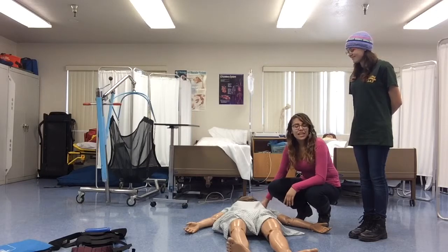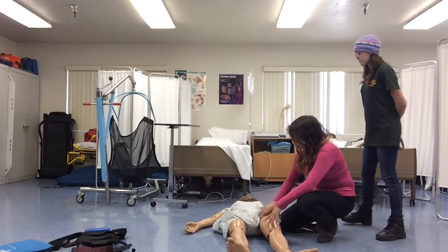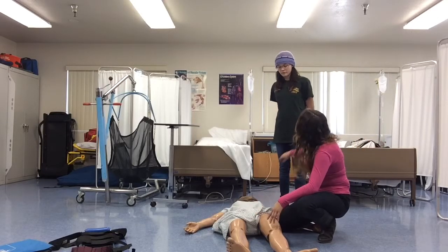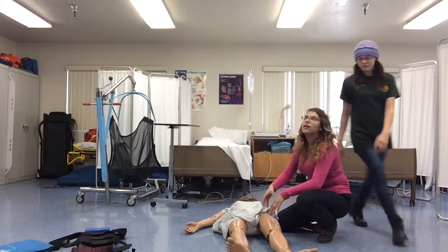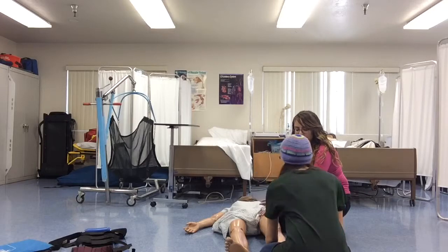Yes. Okay. So the first thing I'm going to do is expose the area of injury. And it appears she has a mid-shaft femur fracture. So Ariana, can you stabilize the patient's legs?